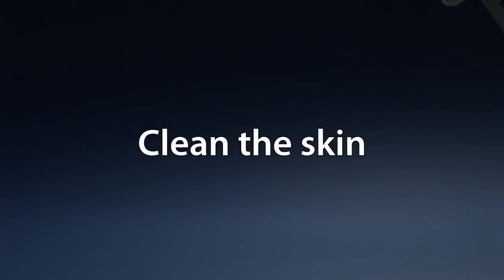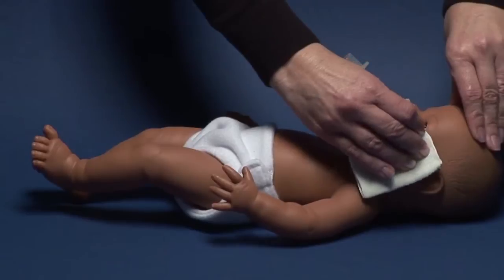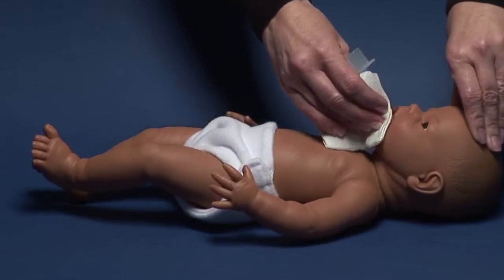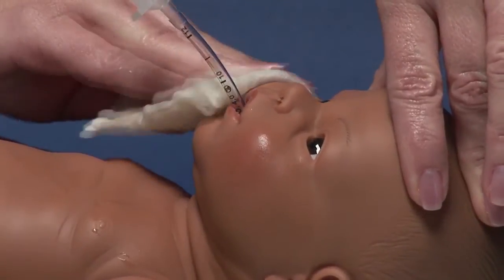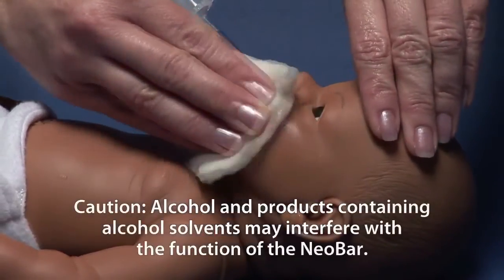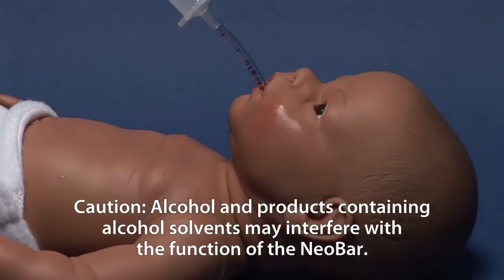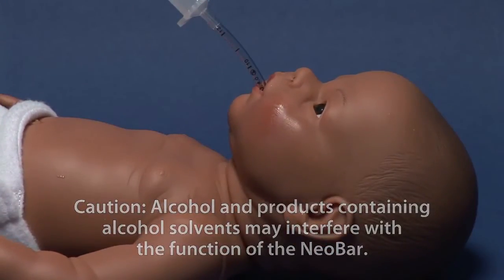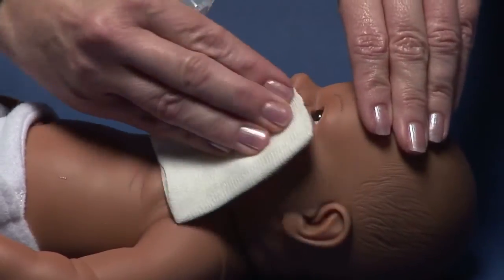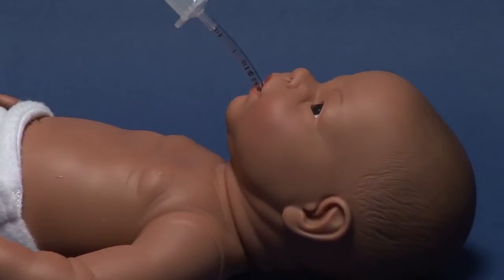Clean the skin. The cleaner and drier the skin, the better the Neobar will adhere to it. Use a soft gauze moistened in plain water to clean the baby's skin. Caution: alcohol and products containing alcohol solvents may interfere with the function of the Neobar. Dry the skin thoroughly. Do not apply any skin barriers to ensure proper adhesion.